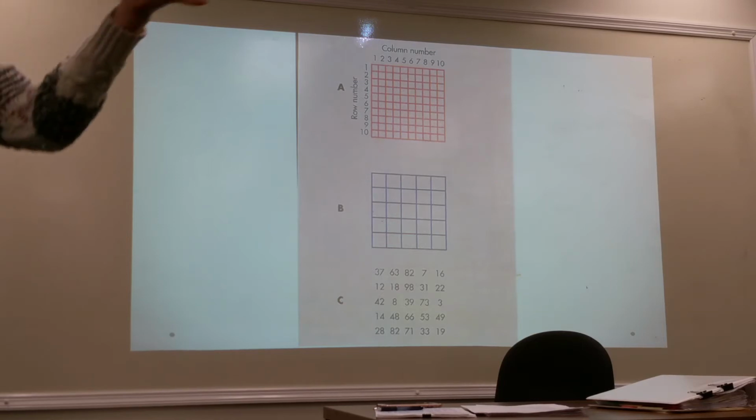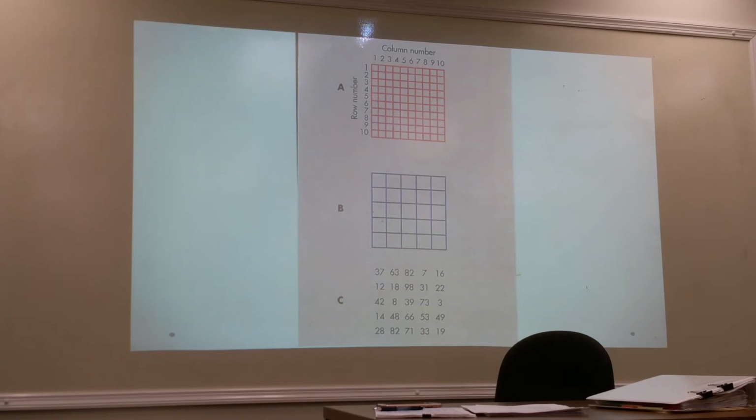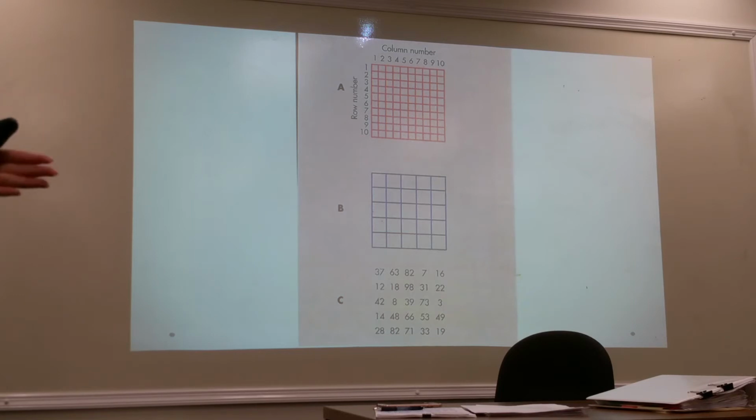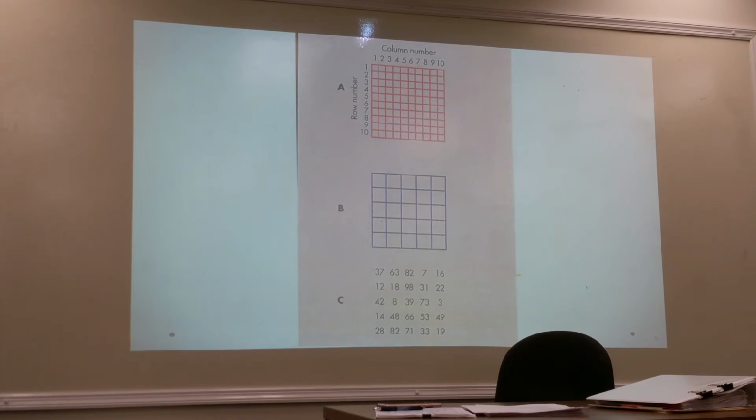So if you're doing anything on the table with the cassette crosswise, you're not getting a full 17 inches. I don't know why it's not 17 by 17, as if you had two 14 by 17s, you could go either way. So you're going to have to be a little bit more precise in your centering for those sorts of things. Anyway, that detector size does not change.